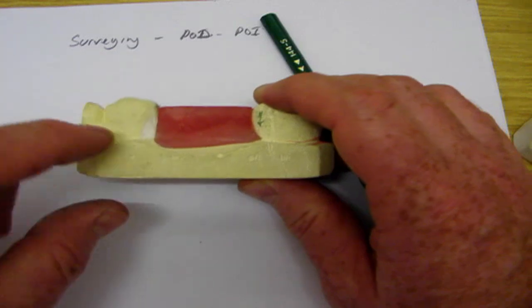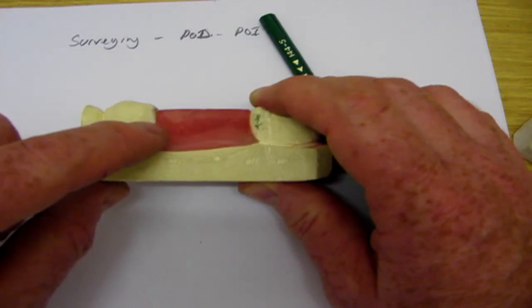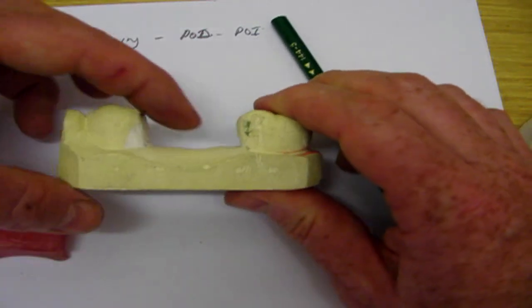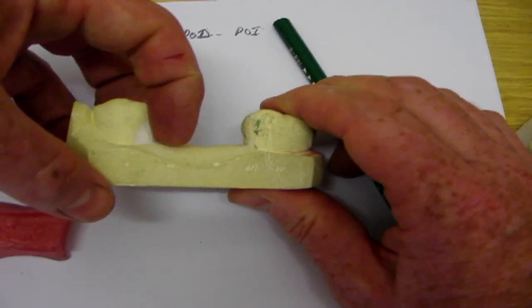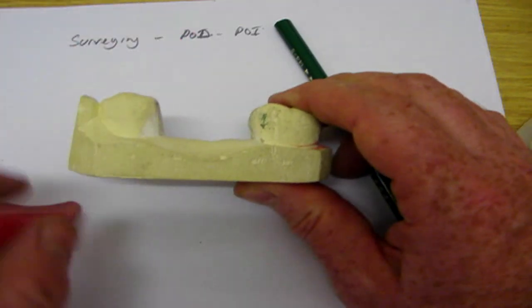Okay. It does mean that you'll have a larger gap here, distal to the premolar, because we've had to block out the undercut relative to the mesial of the molar. So there's going to be a gap when this denture gets fitted in the patient's mouth where I've blocked out the undercut distal to that premolar.